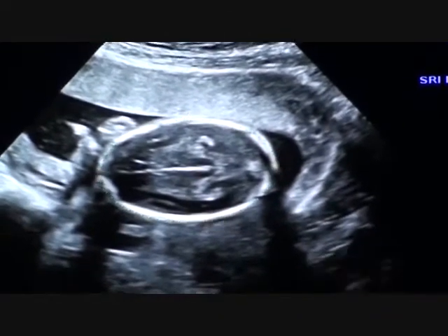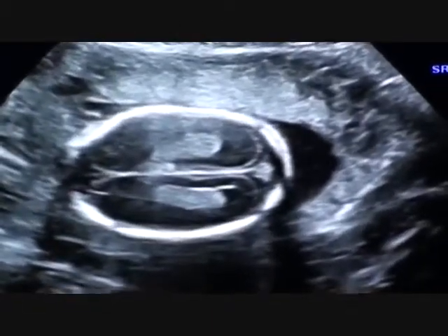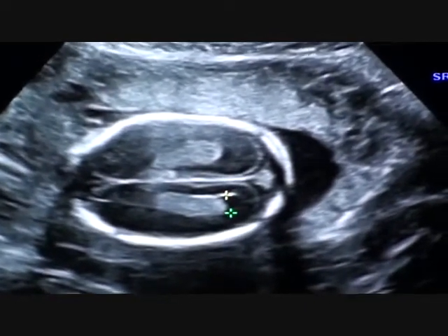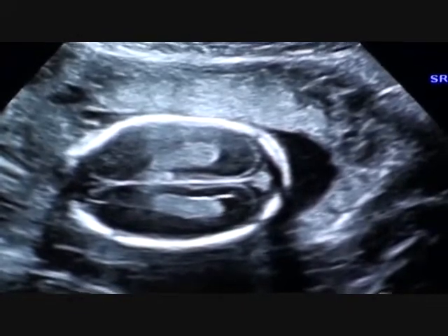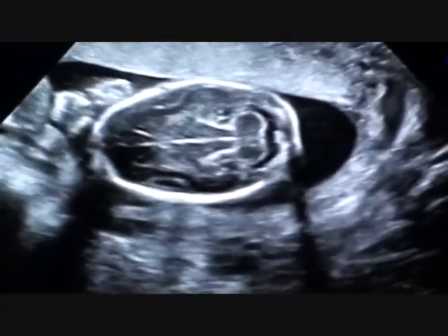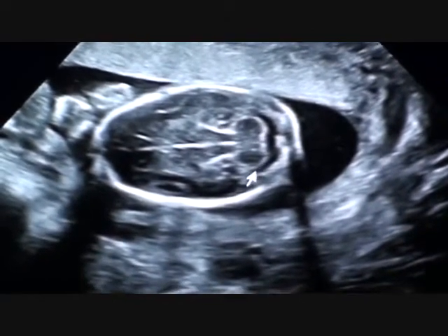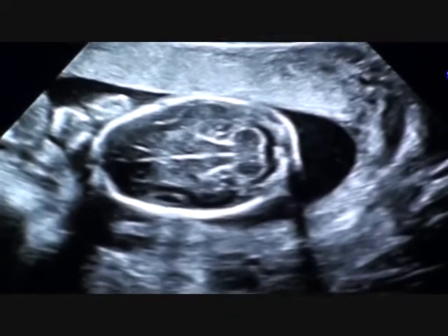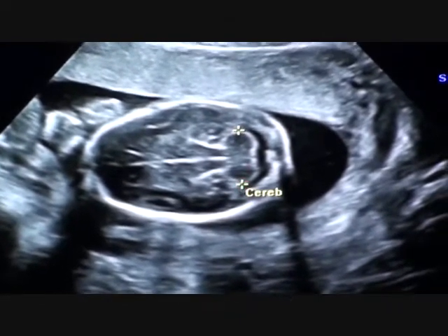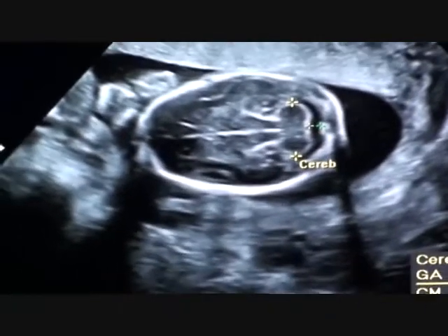I'm going to measure some of the brain structures. This one's called the lateral ventricles behind the brain. We want to make sure the ventricles don't have too much fluid in the space here — that's a normal measurement. We also measure a structure in the back of the brain called the cerebellum, right here. That controls coordination and balance. I'm just looking at the shape of it, making sure the space behind it isn't dilated with too much fluid as well. Both of those look normal.